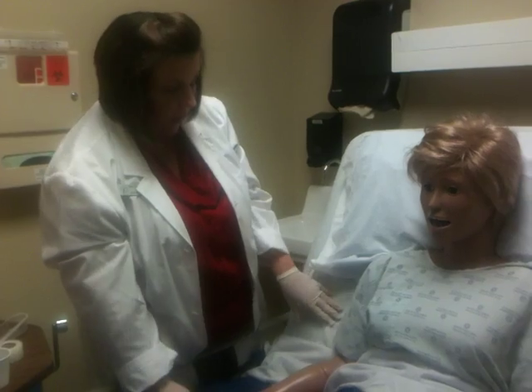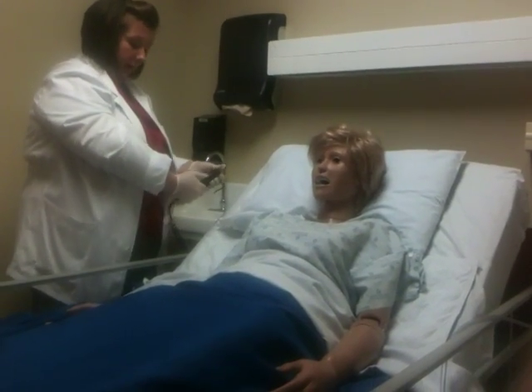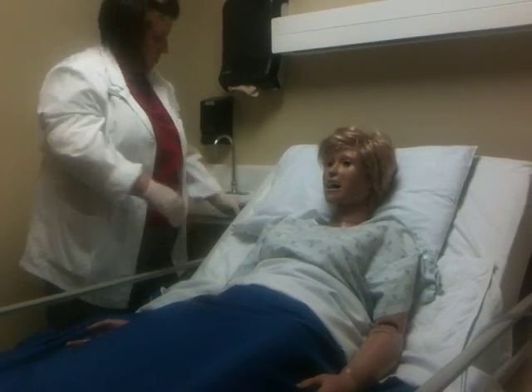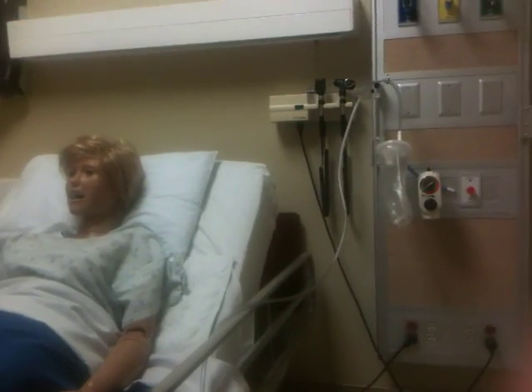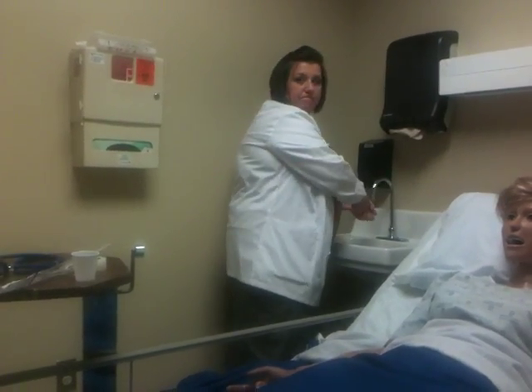And go ahead and give her call light, put her in a comfortable position. Put her bed all the way down. Side rails up. You would need to dispose of your suction canister equipment because it'll have things in it in the biohazardous waste. Okay? Clean up your supplies. Remove your gloves. And then you would perform your hand hygiene. Then you go out and document. That's it.